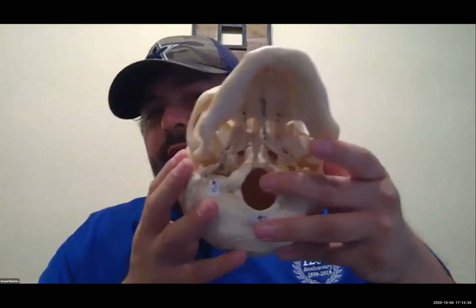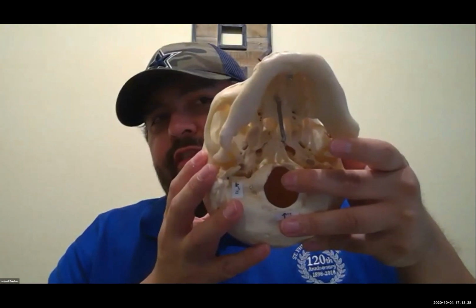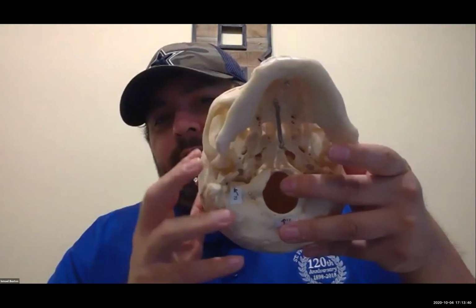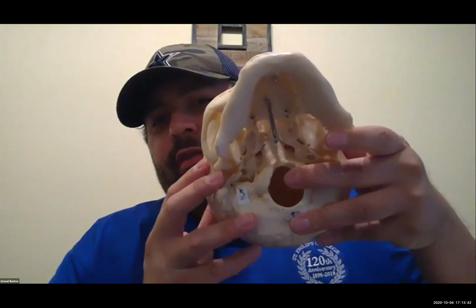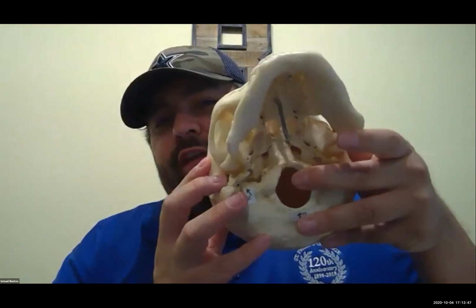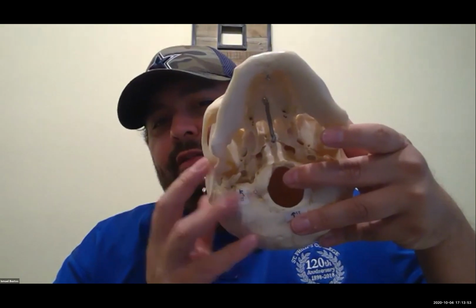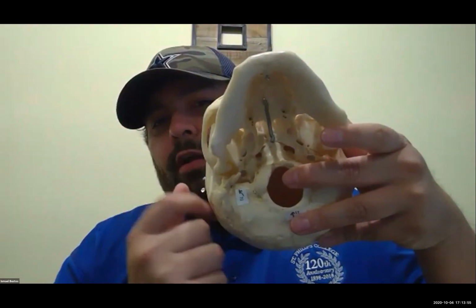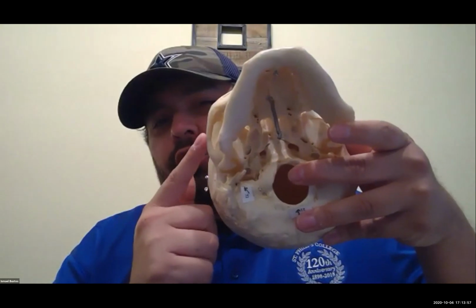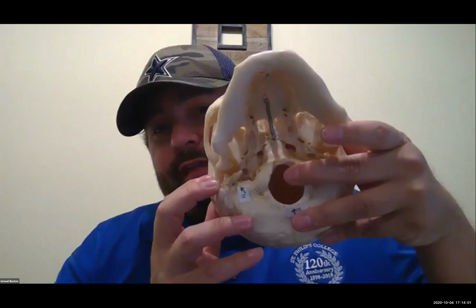Okay, so if you notice, again, let me move over this way. Very difficult to see the zygomatic arch, right? So we're going to rotate 15 degrees. This is my right side, I'm doing the right side. So I'm going to rotate 15 degrees, and then notice, I'm going to tilt the chin again to my right side 15 degrees. And you see how that little space opens up right there. It brings this zygomatic arch away from the parietal bone. That's what we want to see.